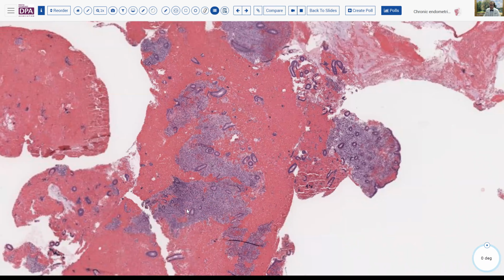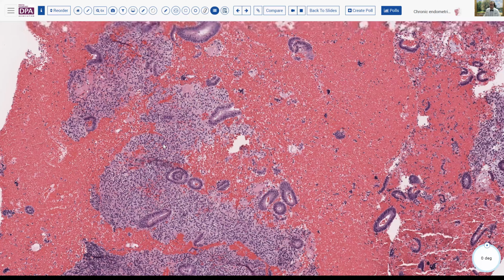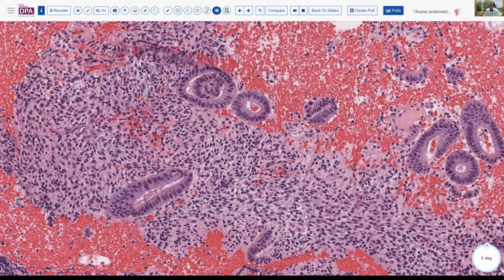And the glands are small, they're not secretory. And so they might look a little bit like proliferative phase glands. But as we look, we notice that there's a few areas of fibrin, a few little fibrin type clots and so forth. And looking over these glands, we don't really see much evidence of very vigorous mitotic activity.